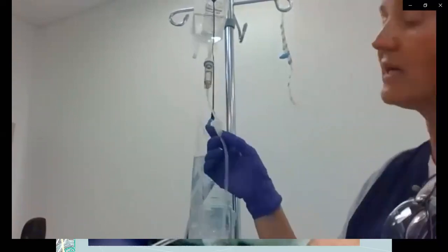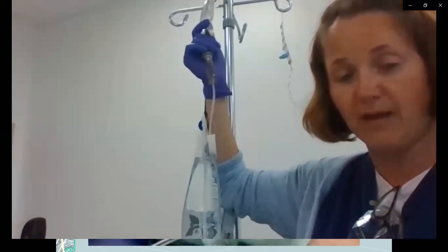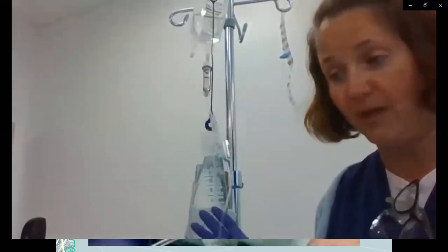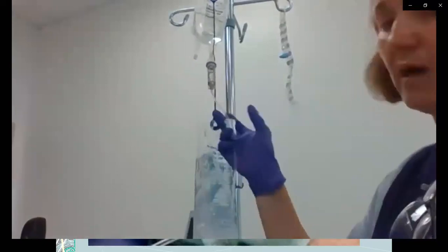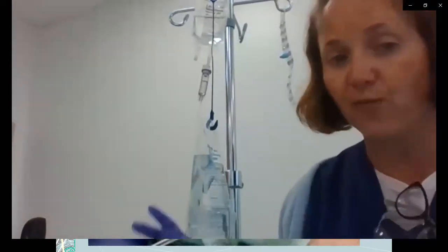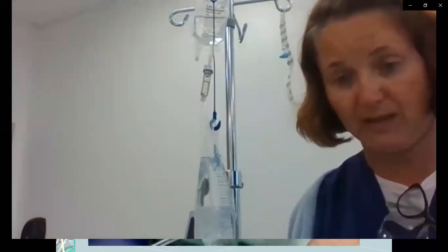So it might be the next person going to give the antibiotics. They go to hang up the next dose of the antibiotic, and the dose before it is still hanging there. So that can be detrimental to your patient's health, right? So we're going to not do that. We're going to make sure that we unclamp this. Always visualize it. Whatever you want to be dripping, before you walk out of your patient's room, you should eyeball that and make sure that that is what is dripping at that time.